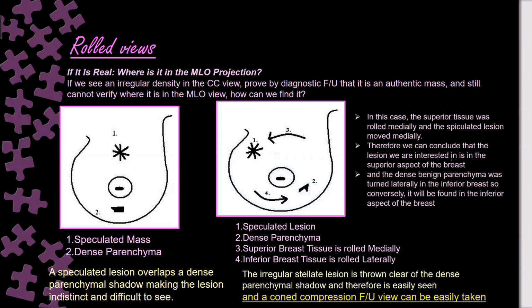The spot compression, if you have a dense breast, might not give you more details. It can help, but sometimes you might still be confused. But if you do this and then do the spot with rolling after you push it, definitely it will give you a better effect.